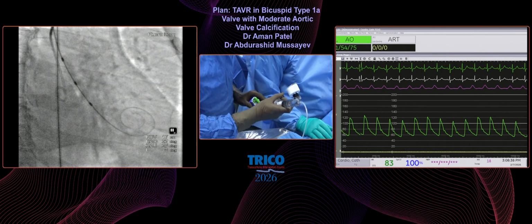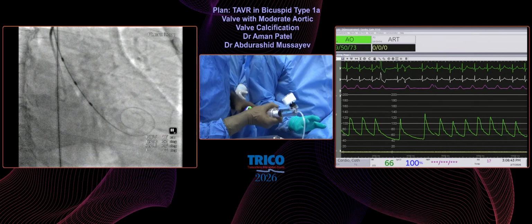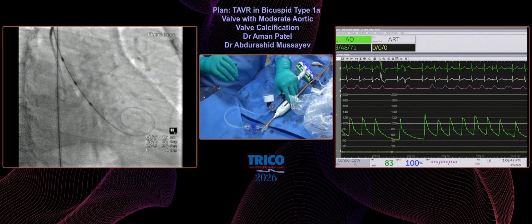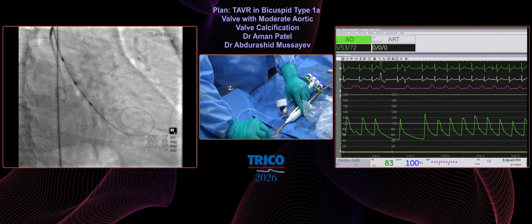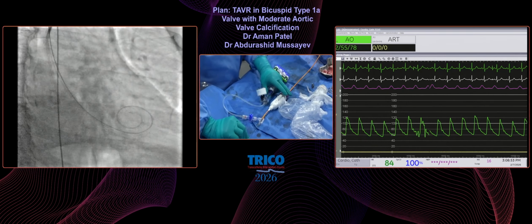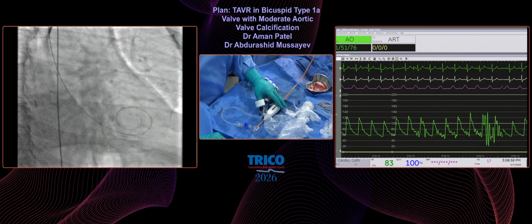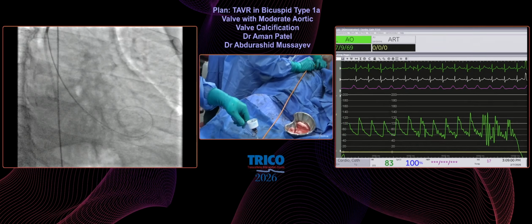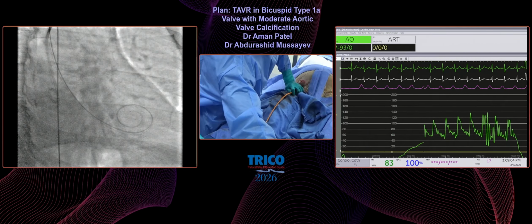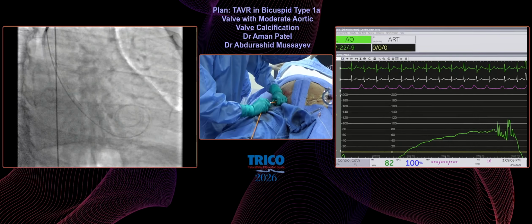I'll give 3,000, please. Okay, that's enough. Aman, do you guys have experience of using the self-expanding valve? Is it available in India? Yes, we have used Medtronic's Hydra. Hydra is again a made in India valve. It was actually a European valve designed by Vascular Concepts and is taken over by an Indian company. And we have some experience in the Microport's Vitaflow Liberty valve.